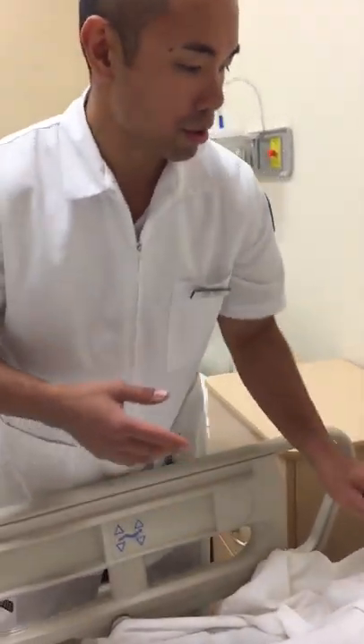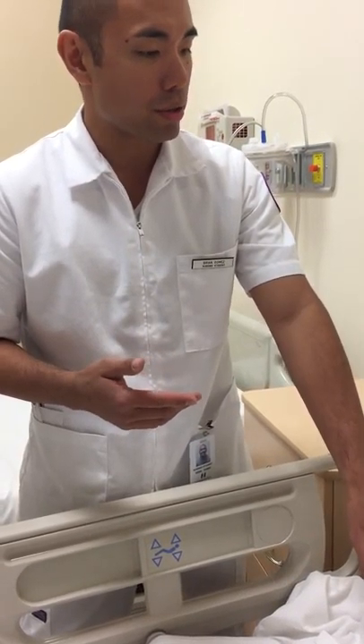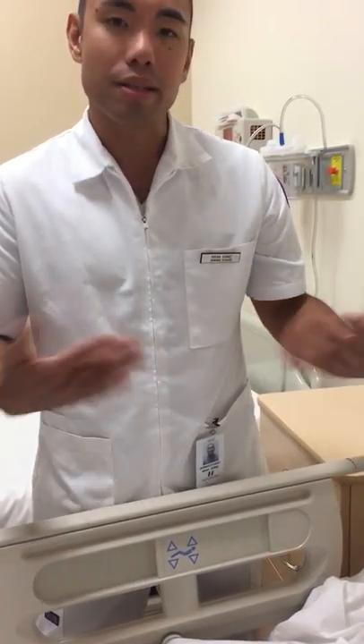So today we're going to be changing the dressing for your central line. Do you have any questions? He says no.